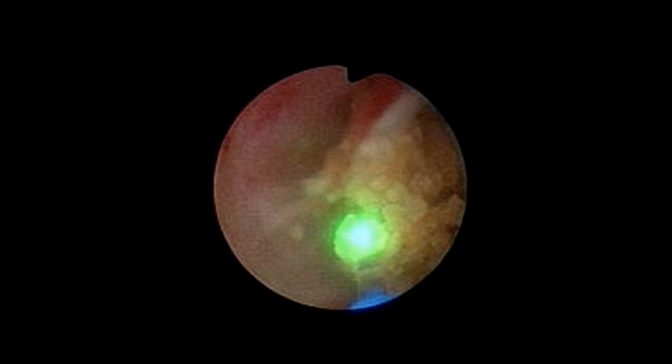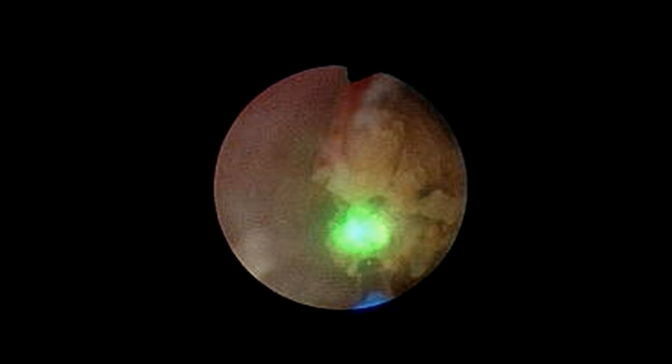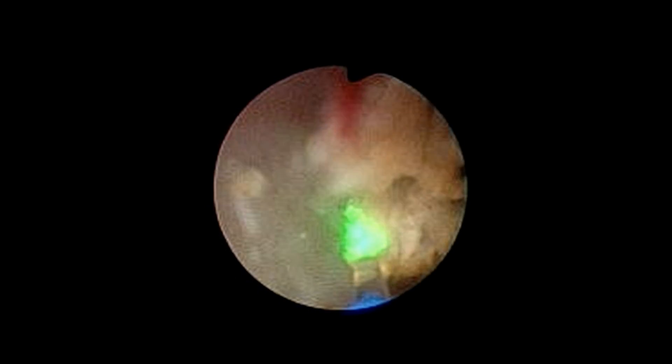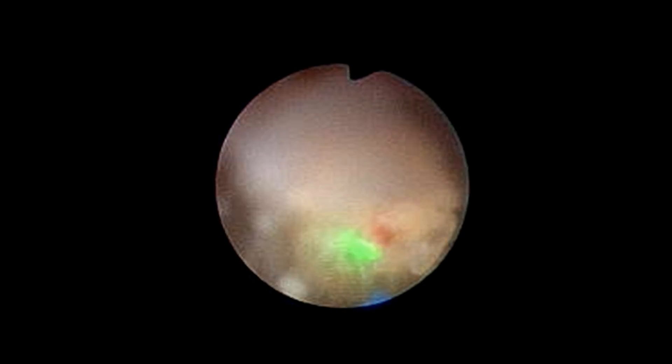In this video I want to show you we are using the Holmium laser with a fine laser probe to reach under vision. Whether using the rigid or flexible endoscopes, we can see the stone — how it is spiky — and we can apply fragmentation, turning the stone into dust.